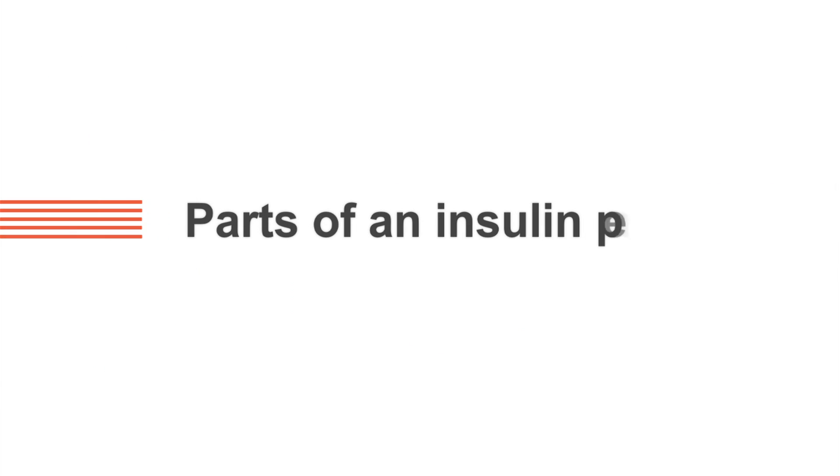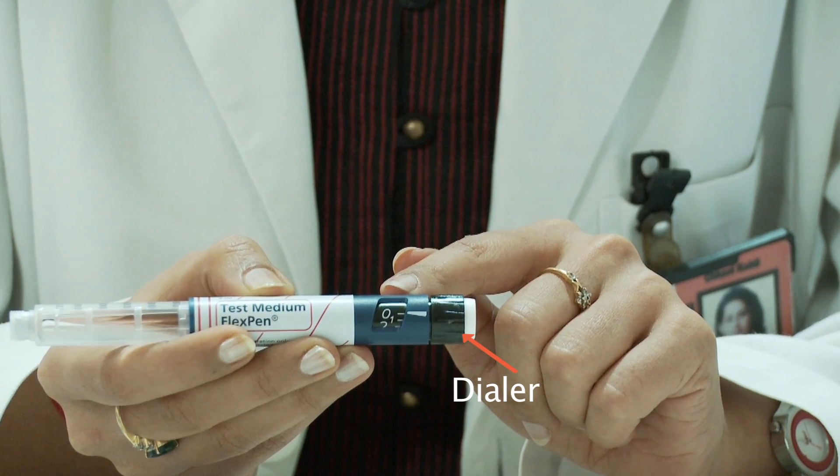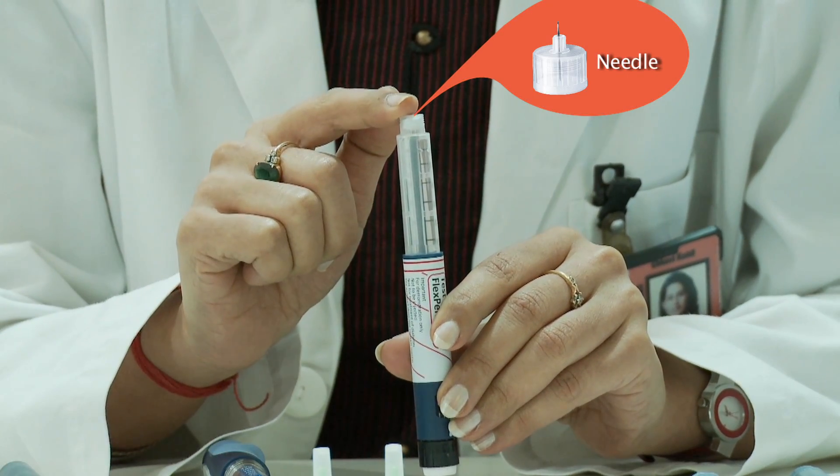Parts of an insulin pen. An insulin pen has three main parts: the dose dialer, the insulin cartridge, and the top of the pen where the needle is fixed.